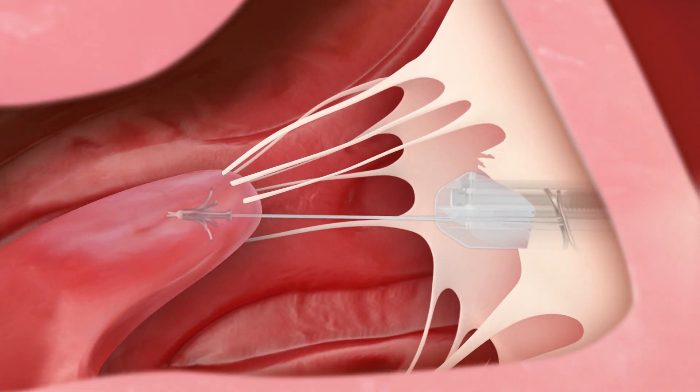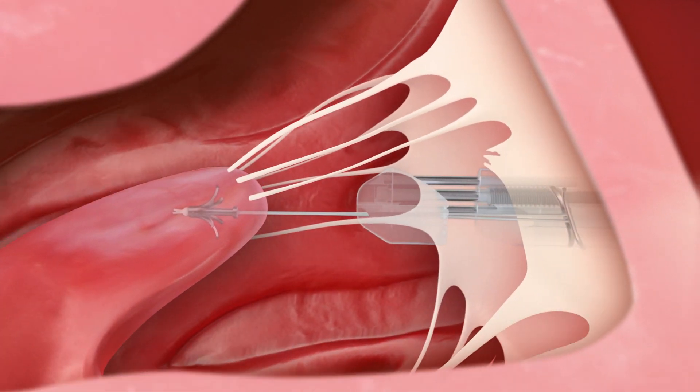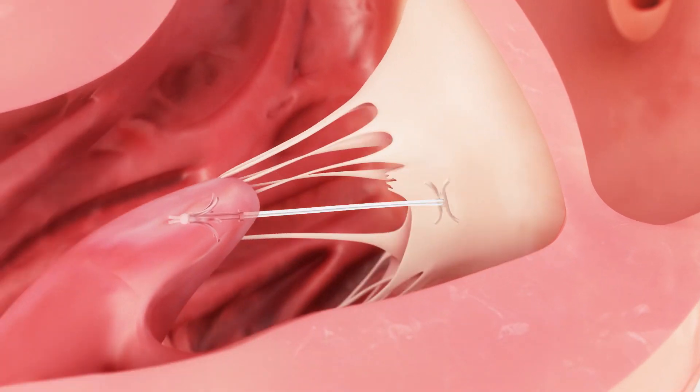Finally, the grasper is opened to release the leaflet. The chorda is replaced by the Cordart implant, restoring mitral valve function.